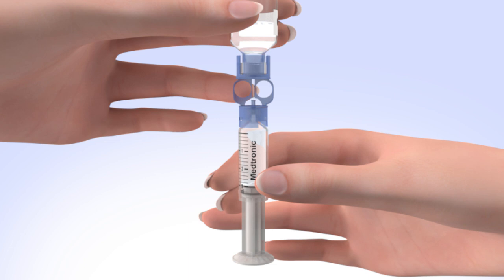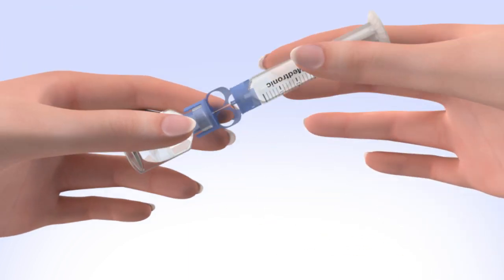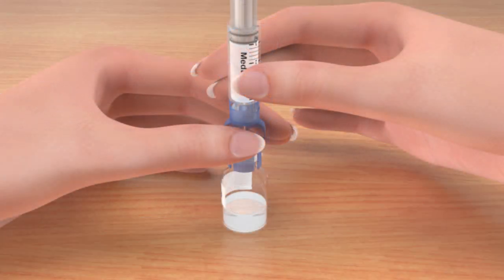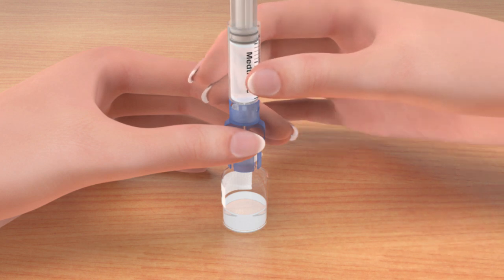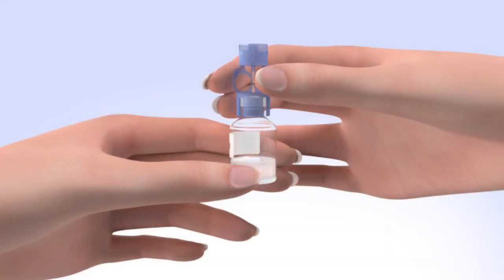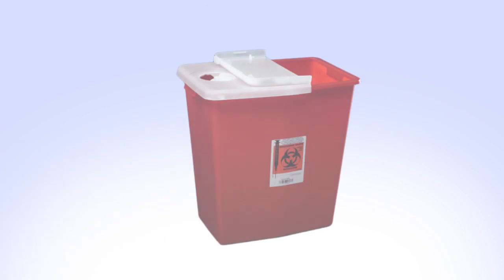To avoid getting liquid on the top of the reservoir, flip the reservoir over so the reservoir is on top. With the vial down on the table, hold the transfer guard with one hand. With your other hand, turn the reservoir counterclockwise and then pull straight up to remove it from the transfer guard. Be careful not to press on the o-rings. Disconnect the transfer guard from the vial and dispose of it properly.